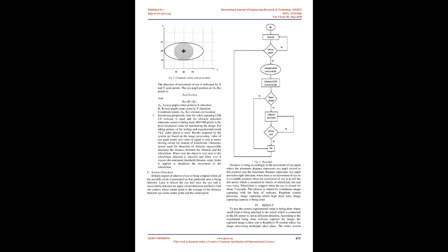The camera module is placed in front of the user's eye. The distance between the eye and the fixed camera device is the most important part. The distance should be 10 to 14 centimeters. The camera captures the image of the user's face to find the exact location of the pupil. After detection of the location of the eye pupil, the system algorithm measures the average values of the center from the eye corner, which gives exact information about the eyeball movement.